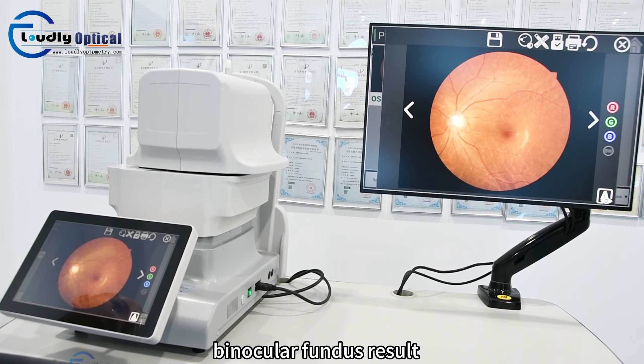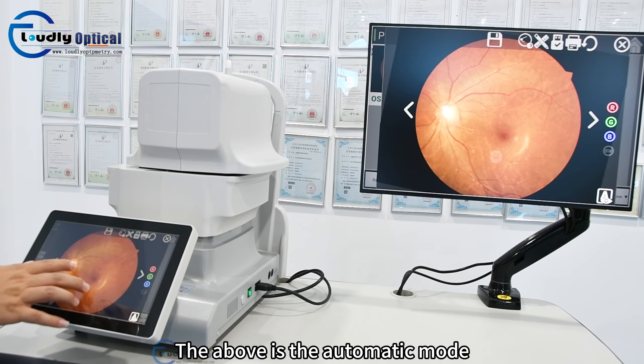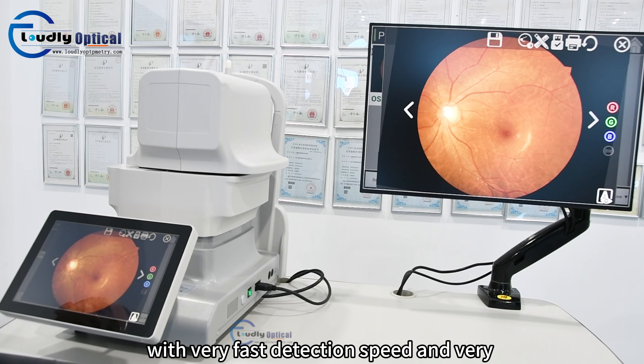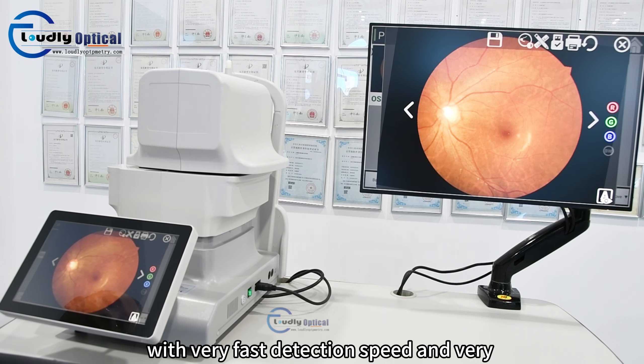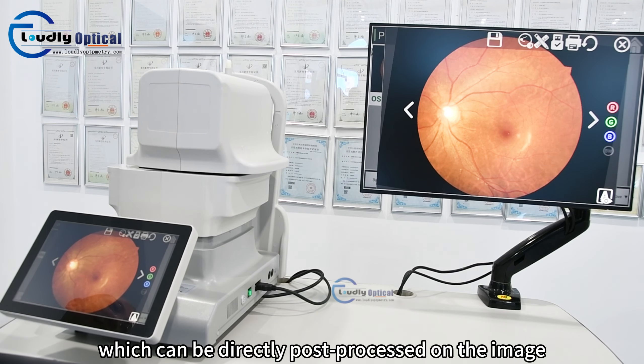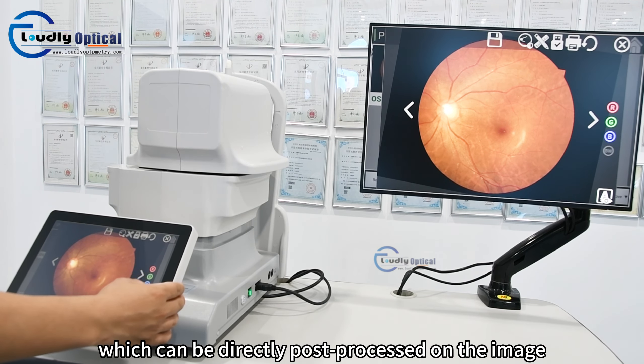Binocular fundus result. The above is the Automatic Mode, with very fast detection speed and very clear imaging, which can be directly post-processed on the image.